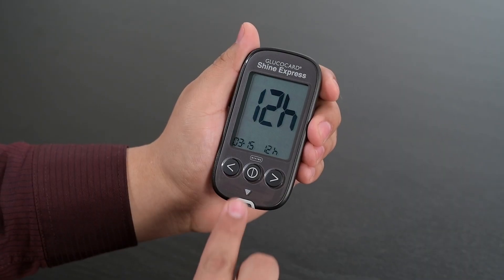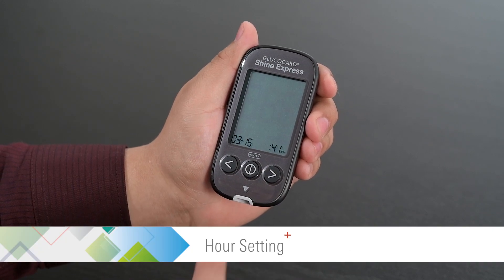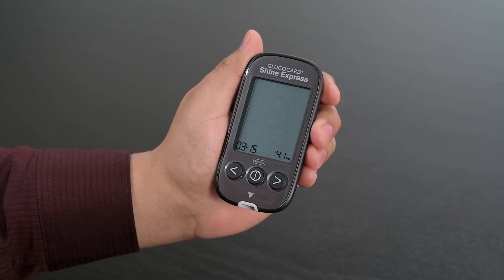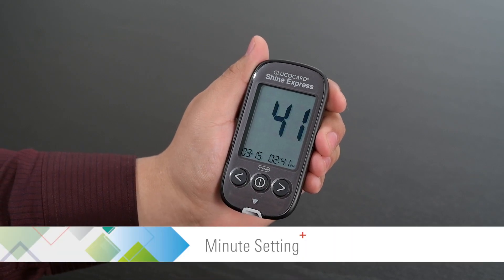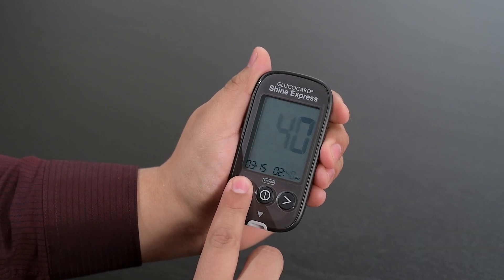Press the center button to proceed to the hour setting. Use the left or right arrow buttons to set the hour. Then press the center button to proceed to the minute setting. Use the left or right arrow buttons to set the minute.